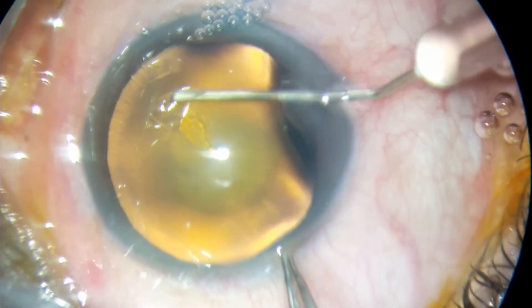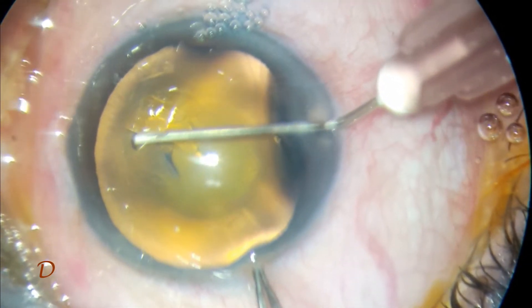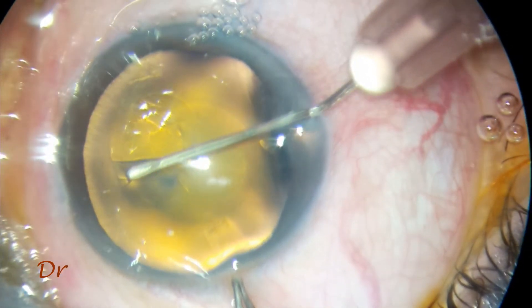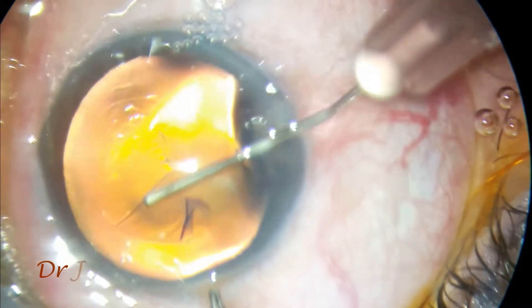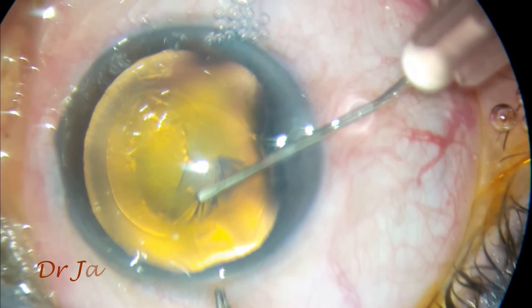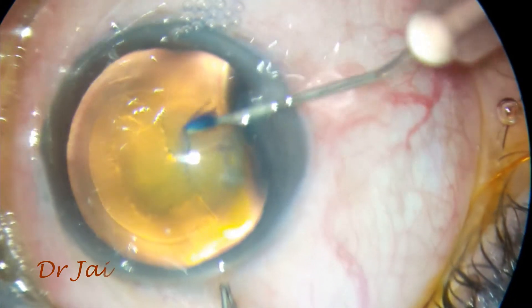I have made two side ports and a main port. I have used trypan blue dye for staining the anterior capsule. Now I am going ahead and making the rhexis. I am using a 26-gauge bent needle which is fixed to the viscocanula.